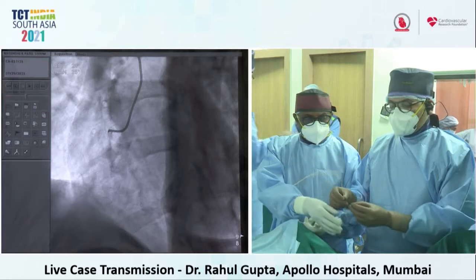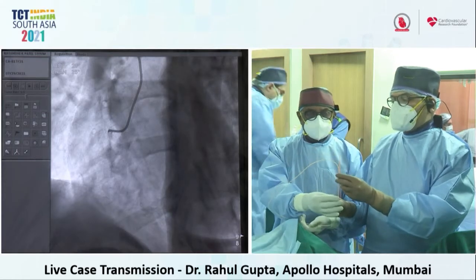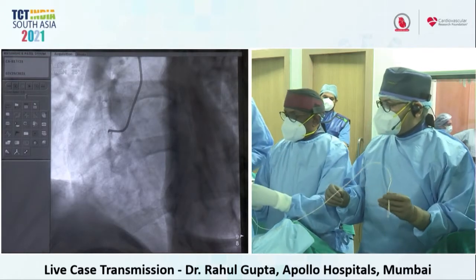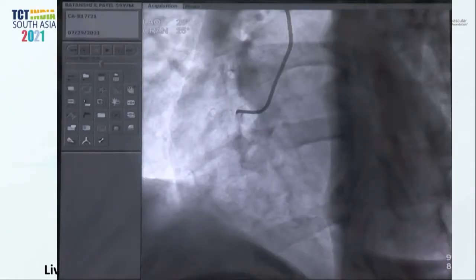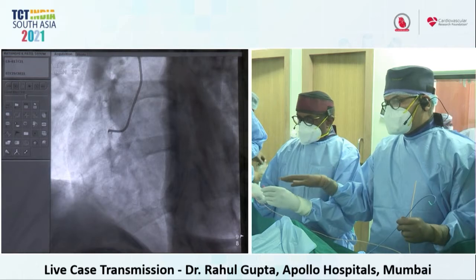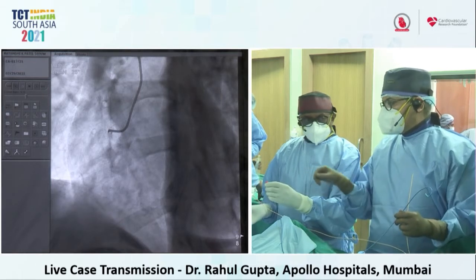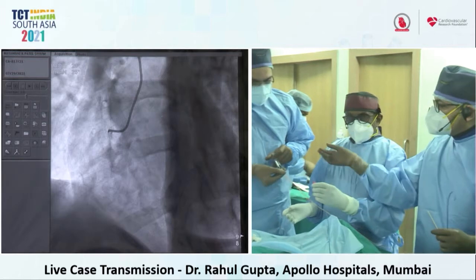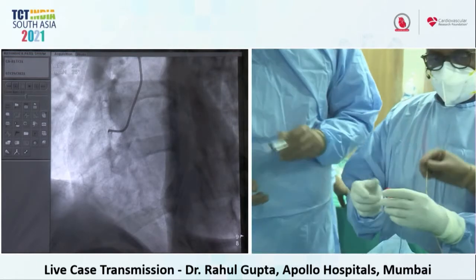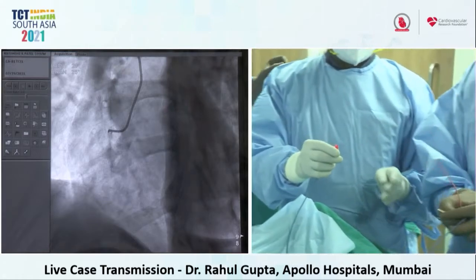So this is that 035 access catheter. We will first flush it, and once we flush it and activate the hydrophilic coating, then we can show their hands, not the coronary angiofluoro picture. Can you please focus the camera, can you show it fully? Okay, so we have activated the hydrophilic coating, just did the flushing of the catheter.